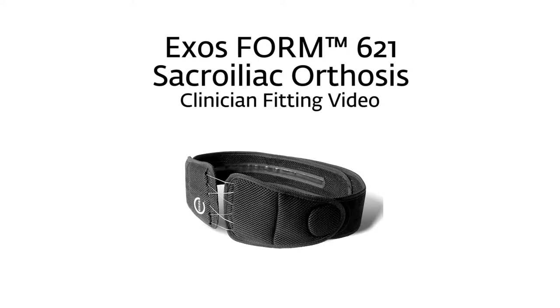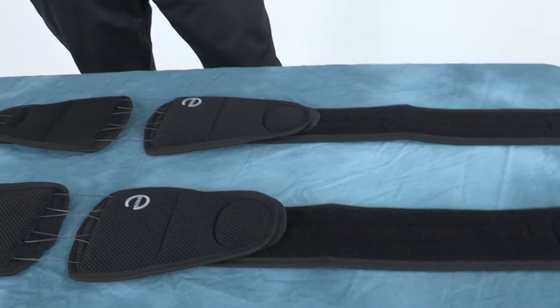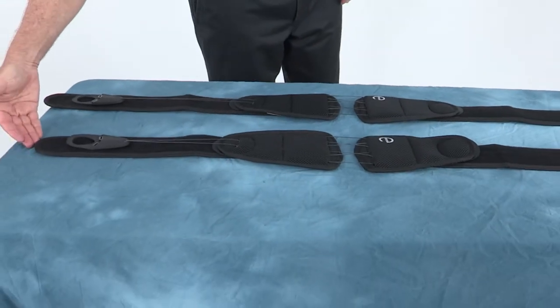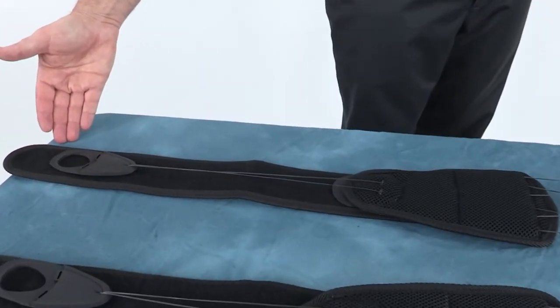This video demonstrates the application and fitting of the ExosForm 621. The ExosForm spine brace is available in two sizes: a small-medium size and a large-extra-large size.